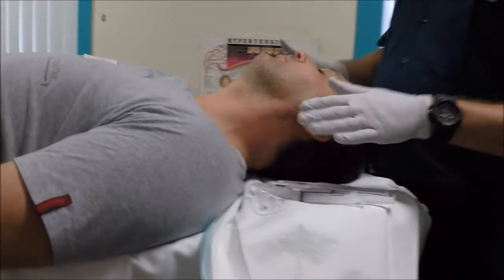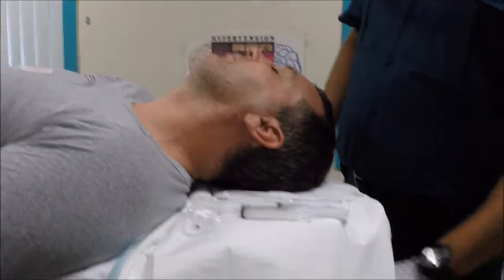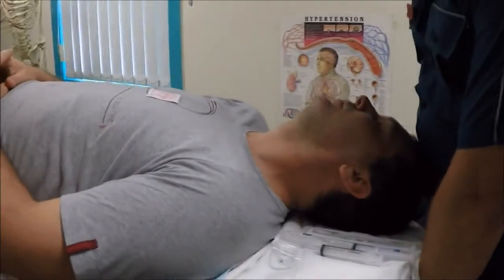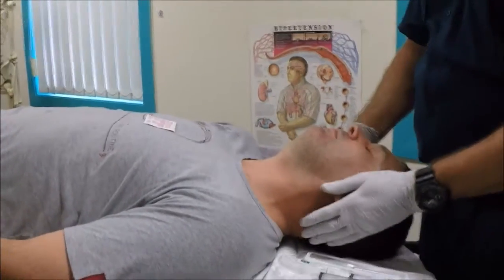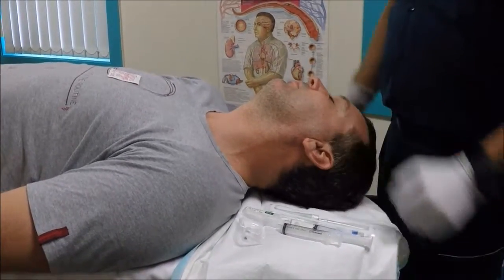For ideal patient positioning, we can put a patient in what they call the Trendelenburg position. So we want to increase venous filling to facilitate us getting a good cannula. By doing that, we can either choose to drop the patient's head 15 degrees, maintaining a good position so he's still in a safe position for me to cannulate, he's at the right height.